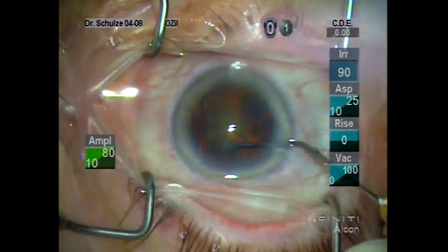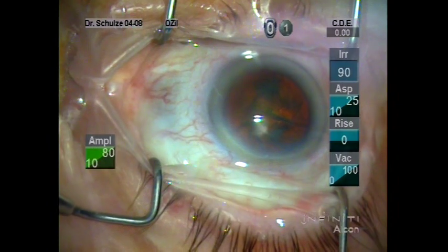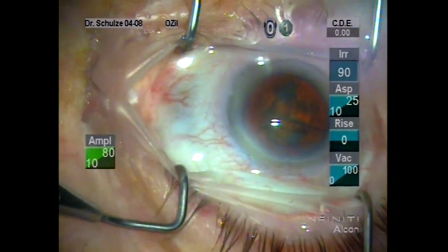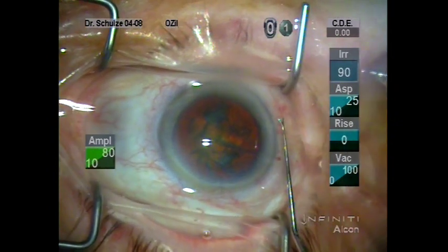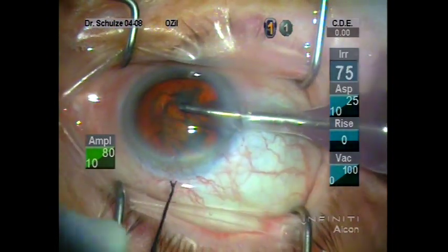I believe less is more — in other words, there's only one injection of the BSS, followed by rotation of the nucleus with the capsule. You can see here we've got our settings on the FACO unit for sculpting, with minimum and maximum set up for both the aspiration and the torsional power.